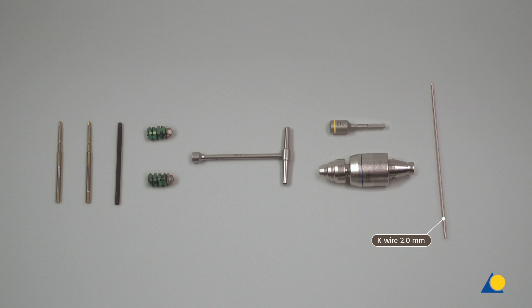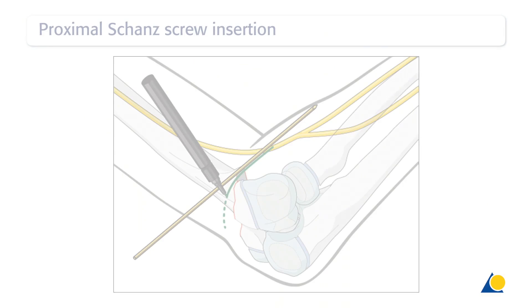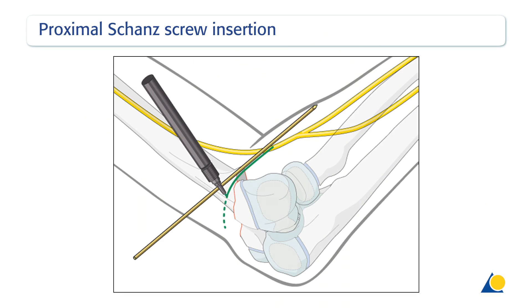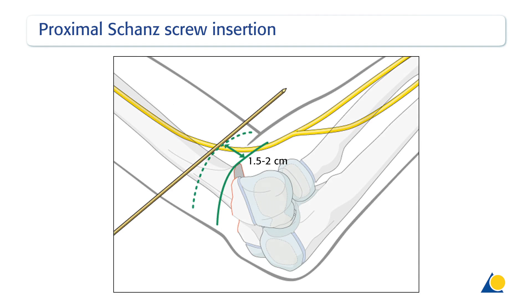The K-wire will be used to prevent rotation of the distal fragment at the fracture site. In a clinical situation, the proximal fracture level is identified under image intensification with the help of a K-wire. Using this line for reference, the safe level for screw insertion is 1.5 to 2 cm proximal to the fracture level. More proximal insertion can damage the radial nerve.